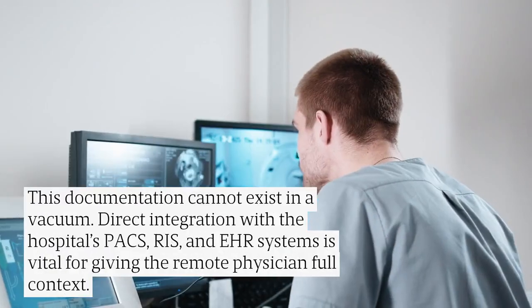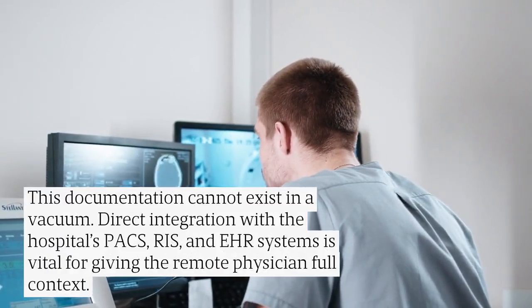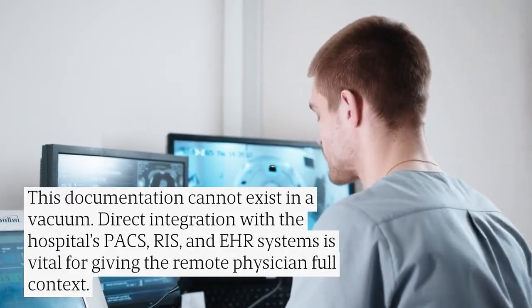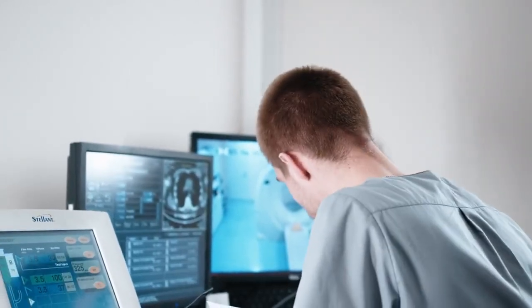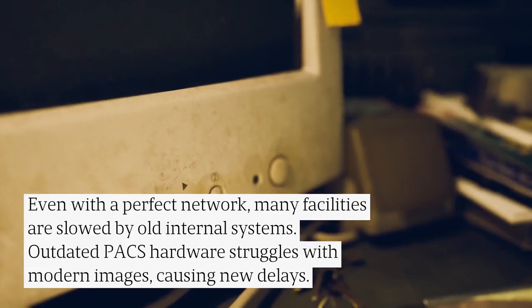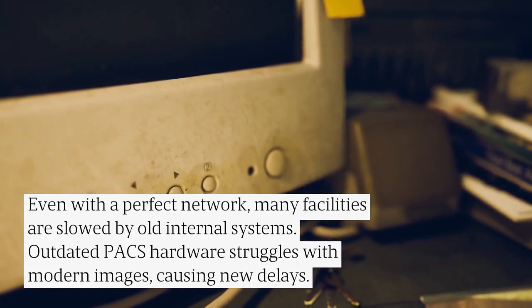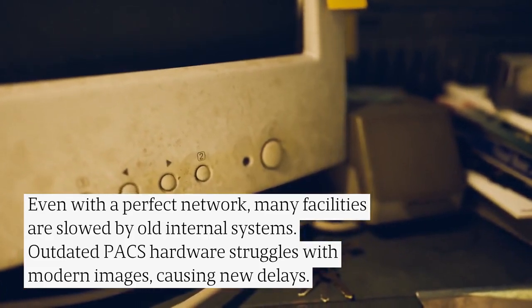This documentation cannot exist in a vacuum. Direct integration with the hospital's PACS, RIS, and EHR systems is vital for giving the remote physician full context. Even with a perfect network, many facilities are slowed by old internal systems. Outdated PACS hardware struggles with modern images, causing new delays.